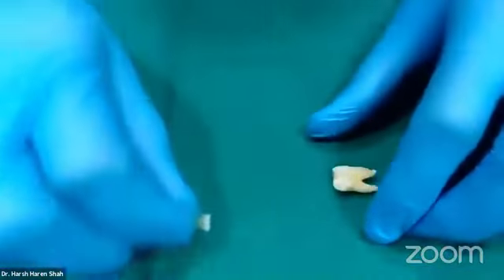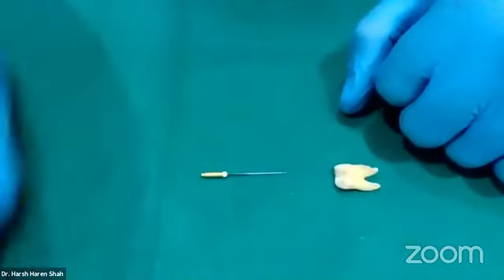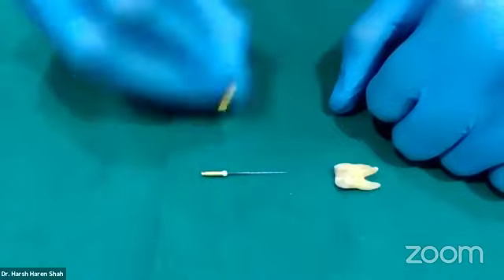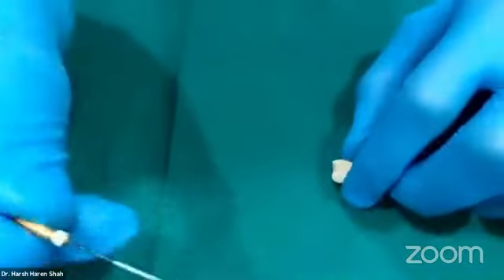Coming to the third method of glide path preparation, which is the use of rotary dedicated glide path preparation files. So let me put this file here. This is the 1G file that we were talking about. It has a white band. The file generally, let me just take it in my finger.